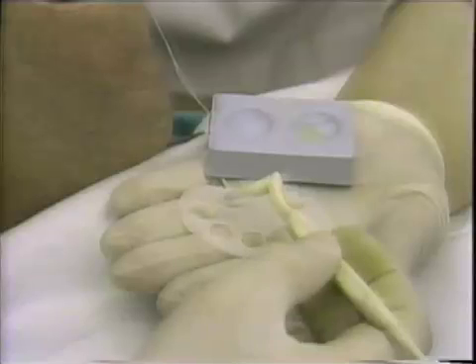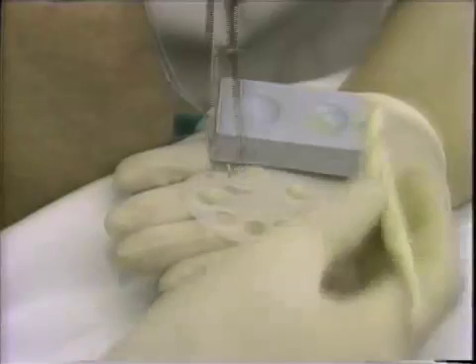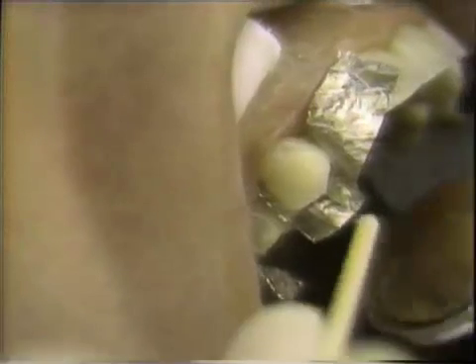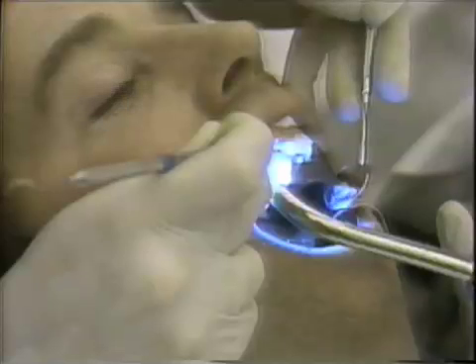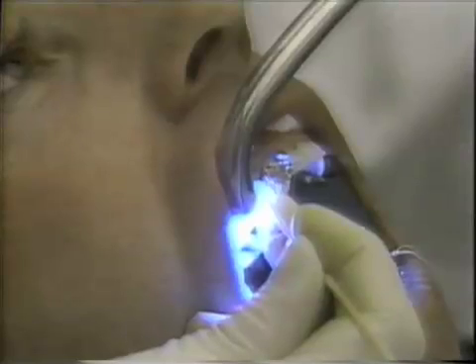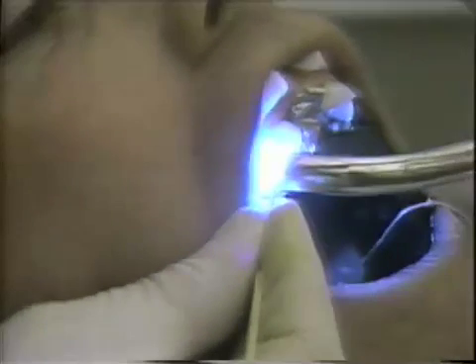The bonding agent is also applied to the laminates. The loaded laminate is placed in the mouth and gently pressed into place, making sure it seats. Once the excess is removed, then the laminate is cured both on the cervical, on the incisal and occlusal. This takes place on all three laminates.